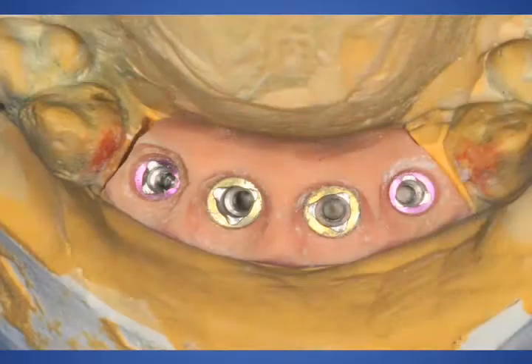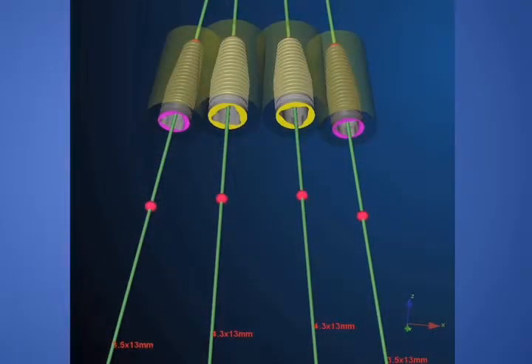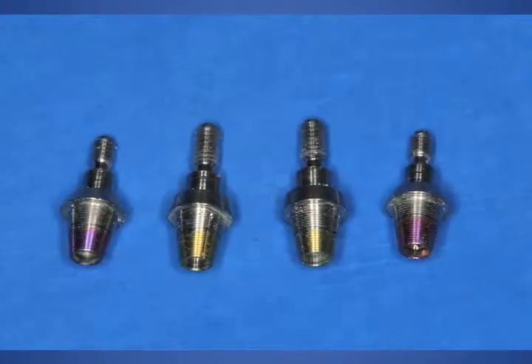After the CAT scan was completed and the Nobel Guide CT scanning software was used, the dental laboratory actually fabricated a model. Again, this is prior to me ever touching the patient, to determine the correct position or ideal position of the dental implants. Again, 3.5 millimeter Replace implants in the lateral incisor areas, and 4.3 Replace Select implants in the 2 central incisor areas. This is all done preoperatively by our dental laboratory.